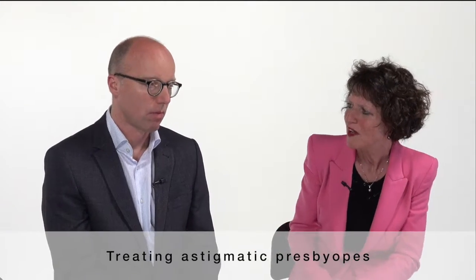I think that we are underestimating the importance of the induced astigmatism by the hand of the surgeon. Don't you have any recommendation? Because I think that everybody, I mean, not everyone, even on the online calculator, we should integrate this value. Don't you have any recommendation for people?